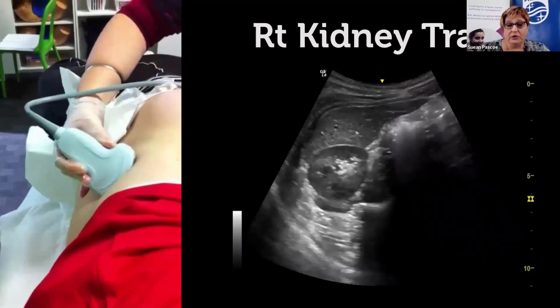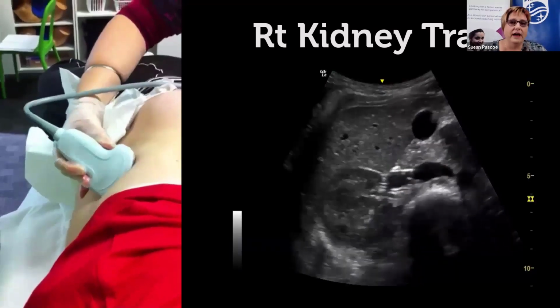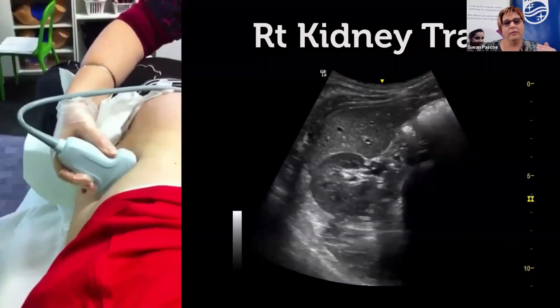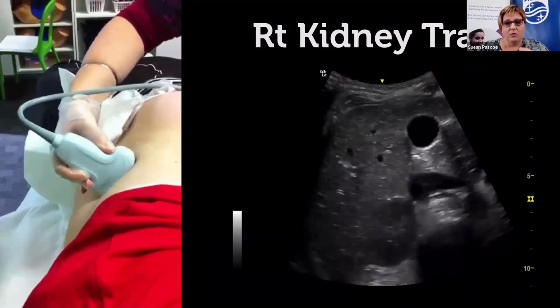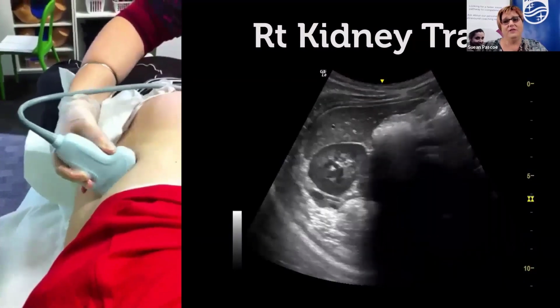Now, this sweep through in transverse is where you're going to properly sort out whether you have a duplex kidney or not, because as you sweep from the northernmost aspect of the kidney to the southernmost tip, you might see round, a C shape, round in the middle, another C shape where you've got the second hilum, and then round at the bottom.